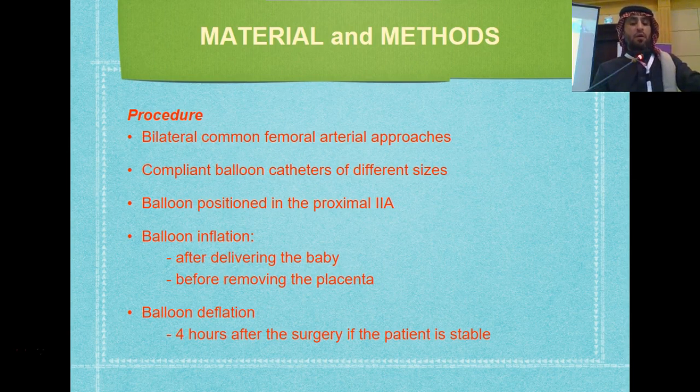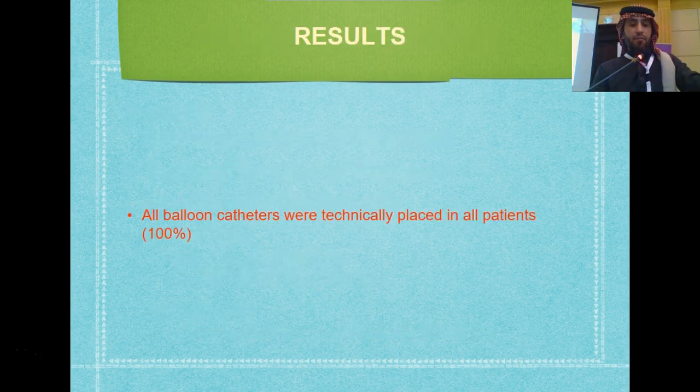It's going to be inflated by our colleagues, the obstetricians, after the delivery of the baby and before removing the placenta, if the placenta is to be removed. And we like to keep it inflated for at least 4 hours until the patient is stable. So our technical success rate is 100%.